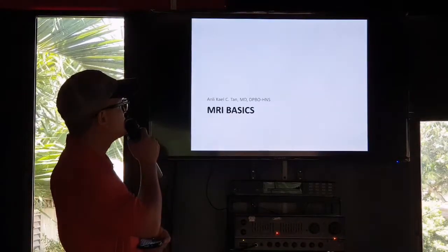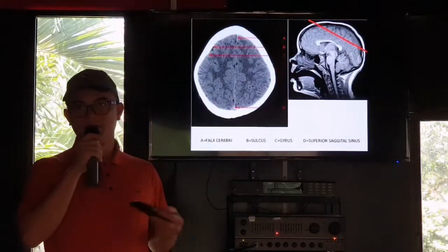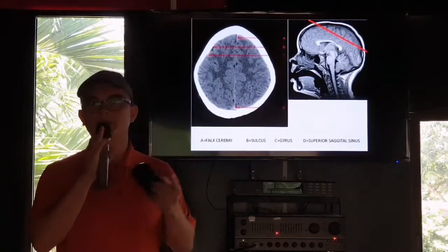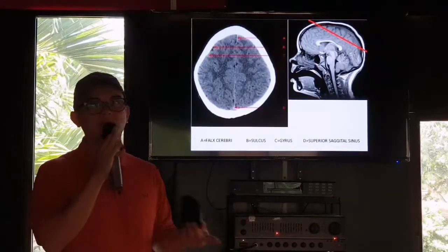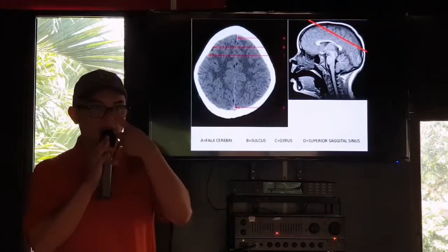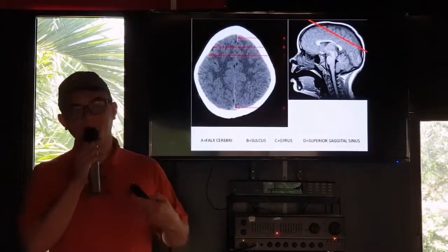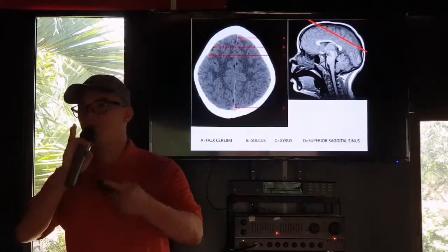So of course, all of those are in soft tissue density. Remember that in CT scan, usually you have what you call windowing and leveling. So windowing, usually you have two windows. You have the soft tissue window, and of course you have bone window. These are the two basic windows, okay? You have other windows, for example, some call it a subdural window and stuff like that. But the most basic are the soft tissue window and the bone window.